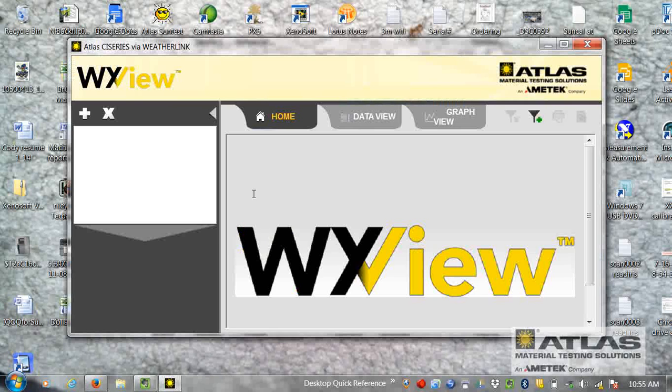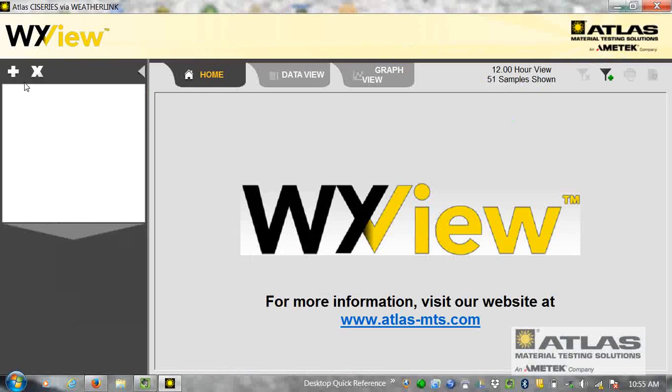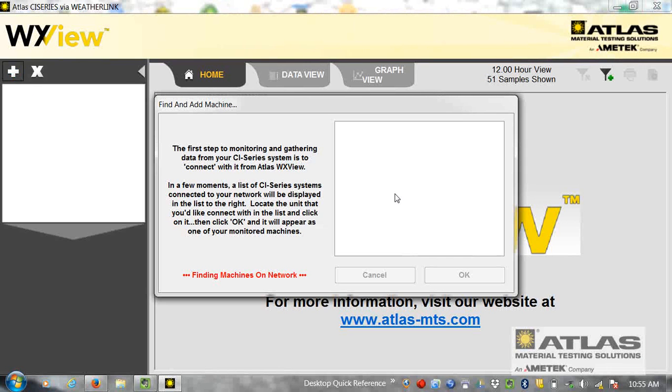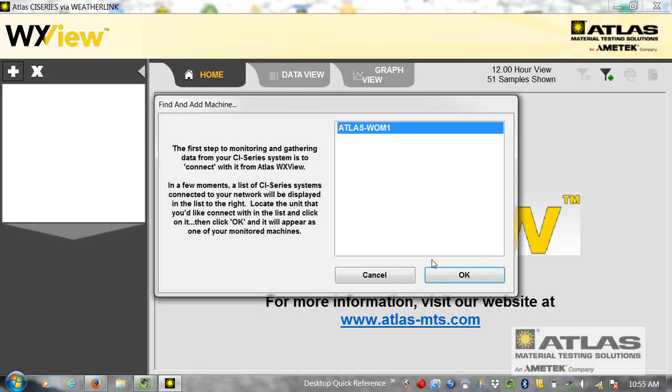So for weatherometer, I want the CI series one, and it's as simple as opening it up, clicking the plus sign. If everything's connected to the network, the computer and the machine, it'll find the weatherometer.